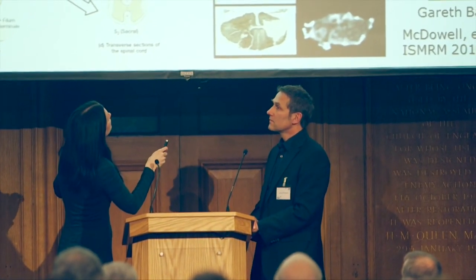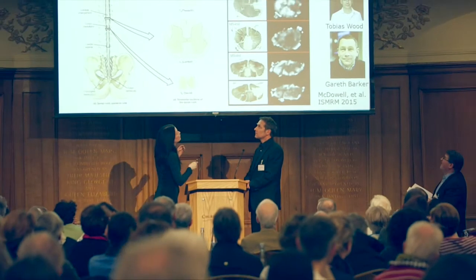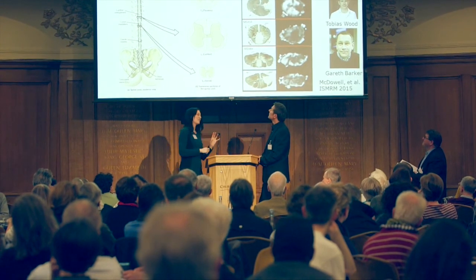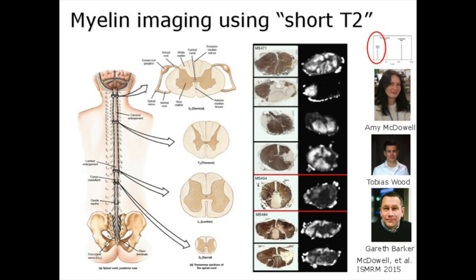And you can see we have signal here where there's myelin, and we have no signal here where there is not myelin. And this does seem to have some sort of relationship. This is really new, only done a few months ago. But we believe that this has some sort of relationship. It seems to be quite proportional.